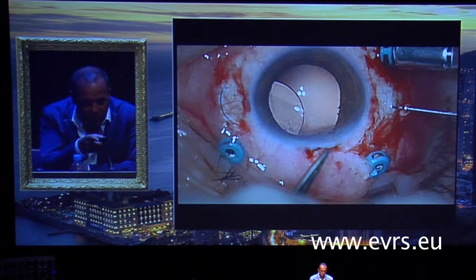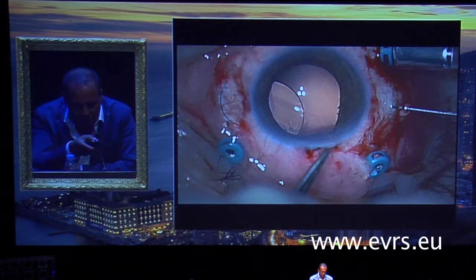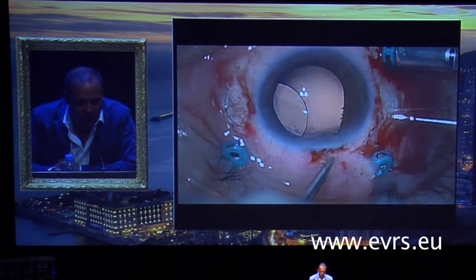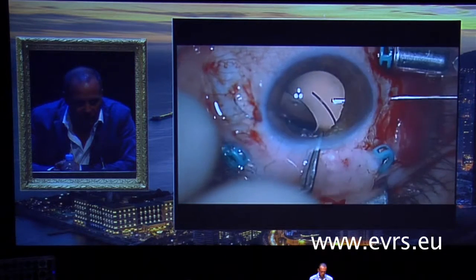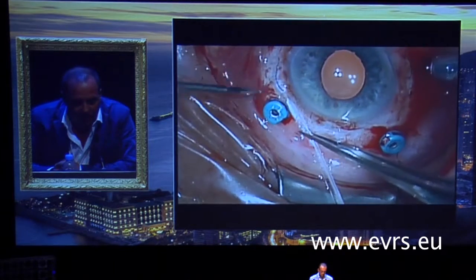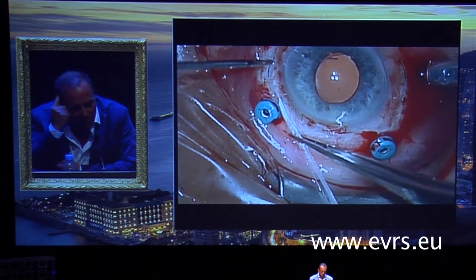The first is this one. Sometimes it happens to me that I bend, break, or lose the haptics when I use the forceps. Can you go on, please? Like in this way, you see, I've lost the haptics and then have to take the haptics again. The second one is sometimes it's difficult to put the haptics into the scleral tunnel.